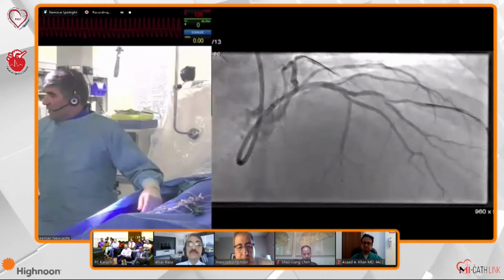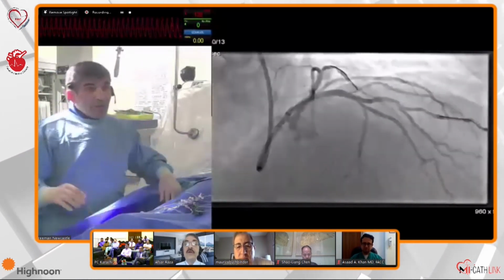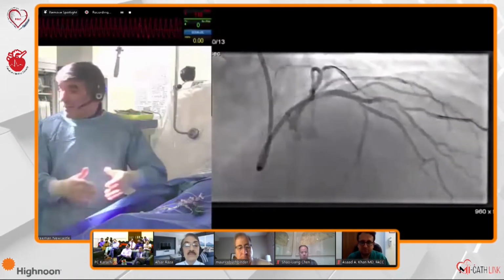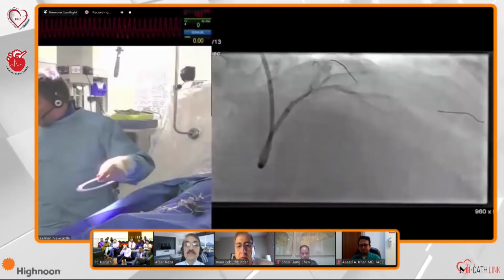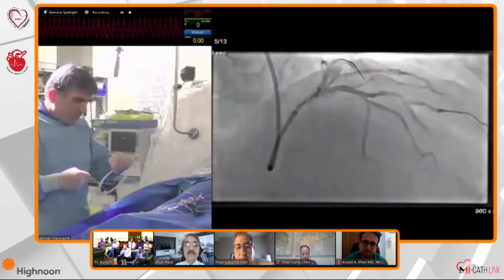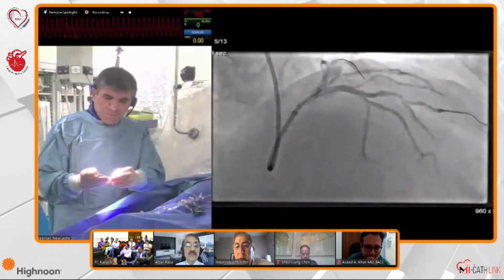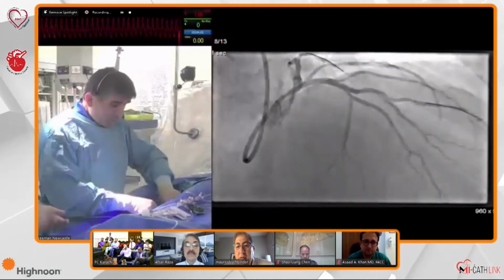Yeah. And often, I know this is how I do it, a lot of people do it differently. I usually take a bigger stent at a lower pressure and then post-dilate, rather than taking a smaller stent and having to go to a higher pressure. I don't know if that's something people do or not, but that's how I do it, because if you look at the compliance chart on most stents, and you know the expansion limit, if you go maybe to 6 or 8 atmospheres, you're probably one step down.